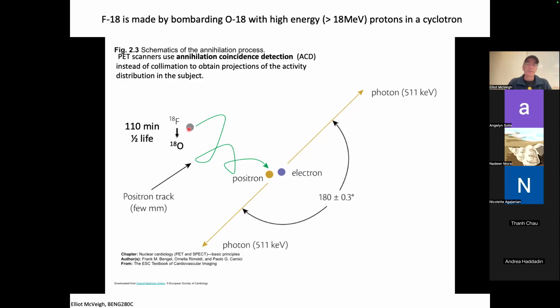During that decay, a positively charged electron is emitted. So the antiparticle for an electron is emitted, and it's called a positron. It has its own name. Most particles have an antiparticle where the charge is flipped, but they're just called an anti-neutrino or something. They don't have their own name, but this one does. The anti-electron is called a positron.